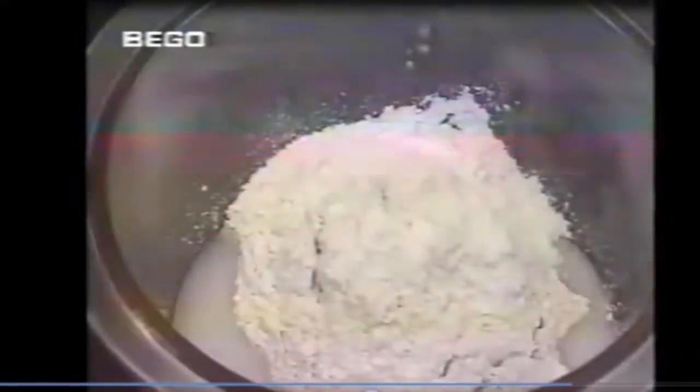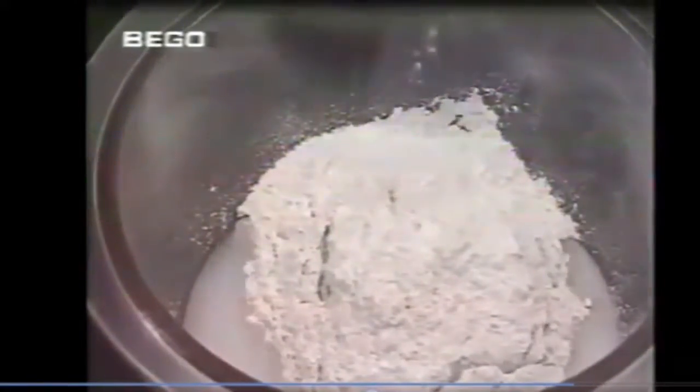To achieve more stability for the muffle, 30% Bego Sol mixing liquid can be used, as well as distilled water. Before power mixing, powder and liquid must be mixed manually with a spatula for about 15 seconds until the material is uniformly moist.